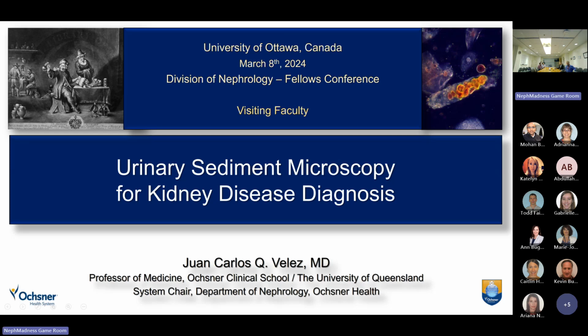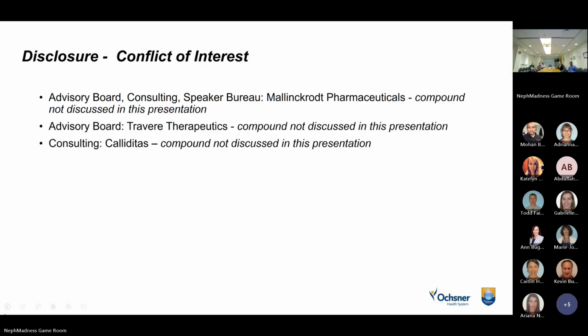Thank you. Good morning. All right, so we're going to discuss urinary sediment microscopy for kidney disease diagnosis this morning. My disclosures: nothing pertinent to this talk today.